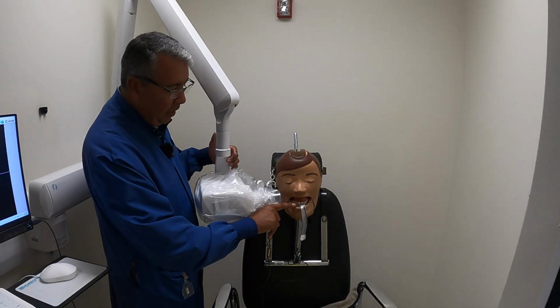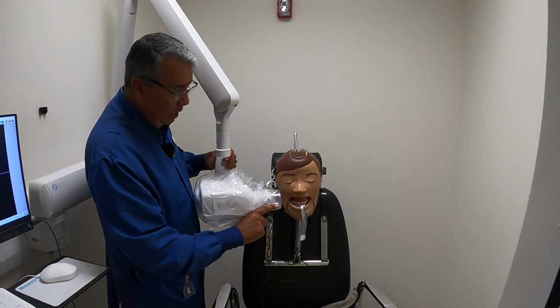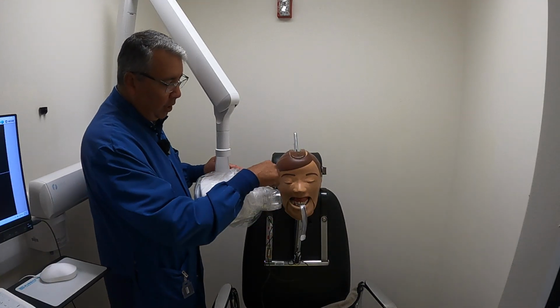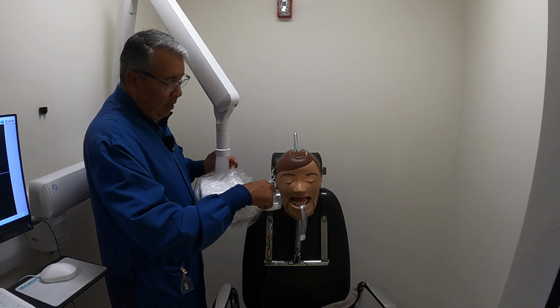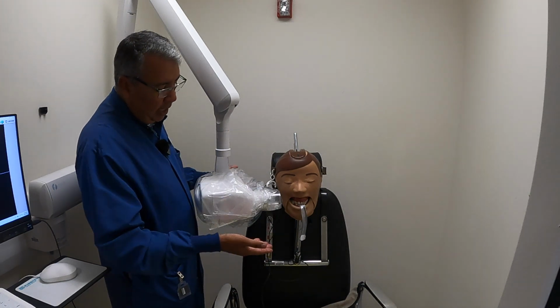Now I'm using my finger and I'm referencing the inside of my finger. If this cone was to extend, you have to ask yourself, where is it going to hit? Because if this cone is too far forward, you're going to get a cone cut on the back side, okay? And we don't want that. So right now we're okay. We're okay from the right side, we're okay from the left side, but we have to adjust the height on here.